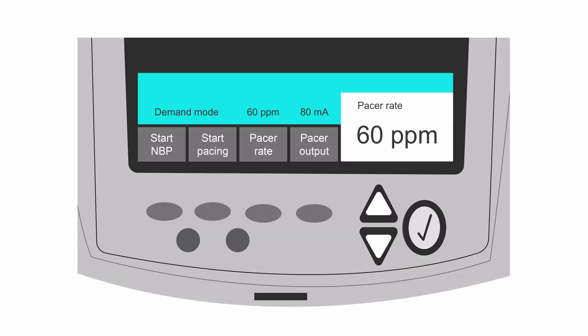Once the pace feature is turned on, there are only two settings you need to control. The rate button sets the heart rate you want, and the output is the amount of energy measured in milliamps required to conduct electricity through the patient's chest wall and heart.